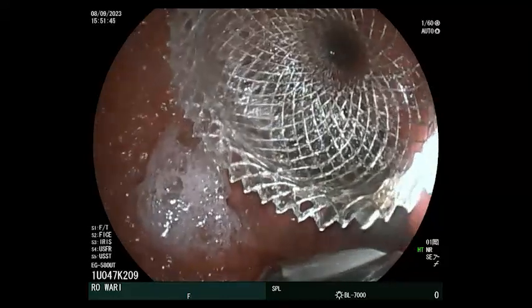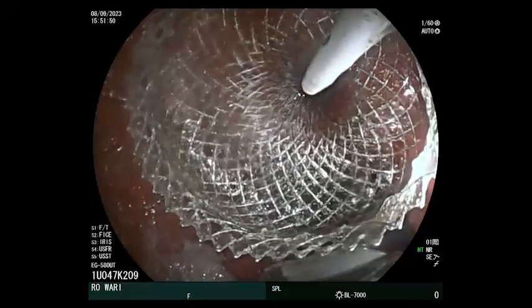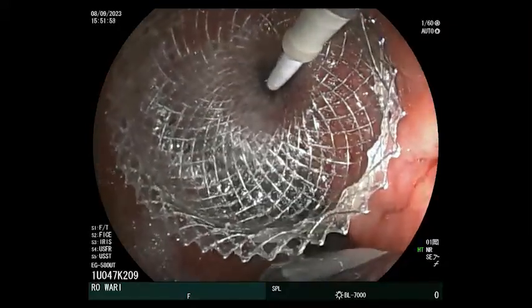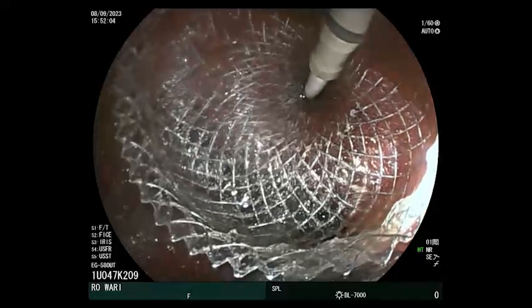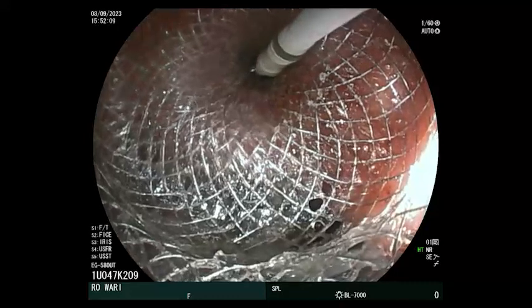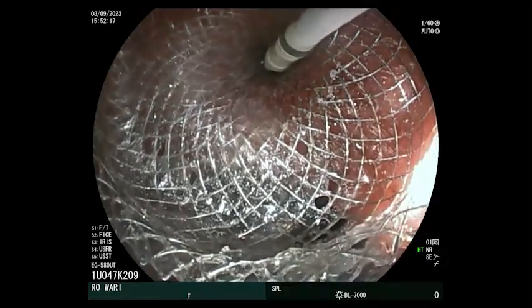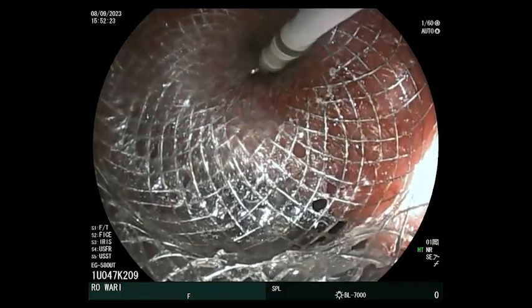Would you dilate now? No, never. Why? I think it is not necessary, it is not mandatory, because finally in 24 hours the stent will be completely deployed spontaneously. You dilate the channel of the stent only in the case that we have misdeployment or dislodgement of the stent. So I'd never take the risk. Even if you're doing a necrosectomy? Yes.